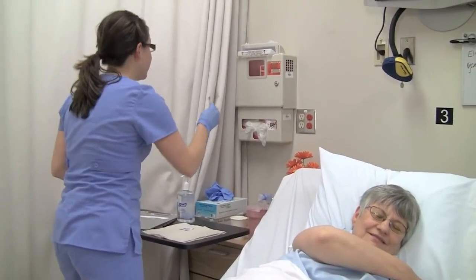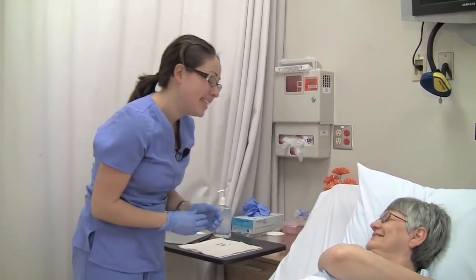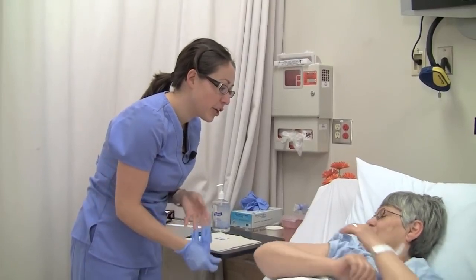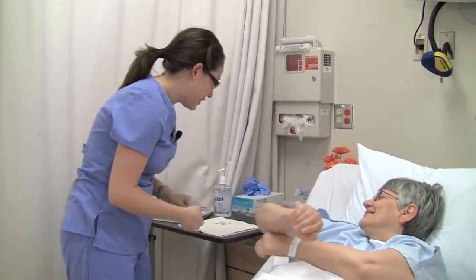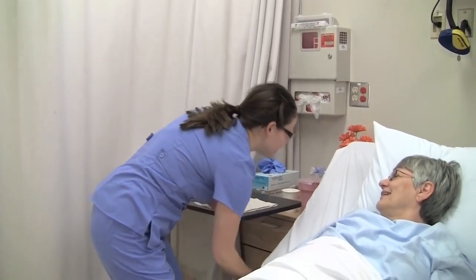Discard the needle and syringe into the sharps container. As always, document that you gave the medication on the MAR, including the injection site. I'm going to let you get some rest, and I'll come back and check on you in a little while. Call me if you need anything at all.